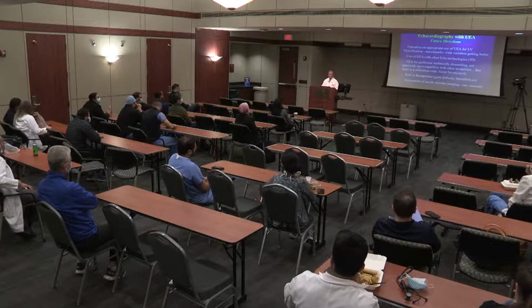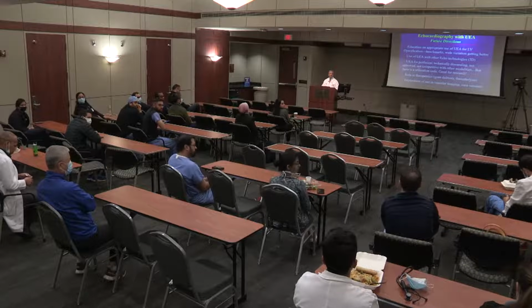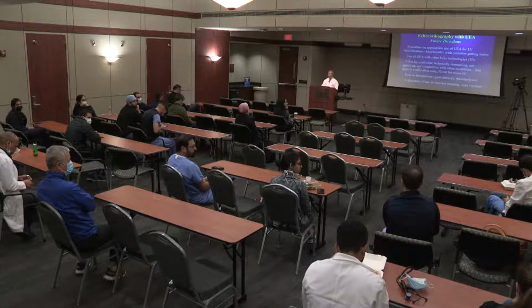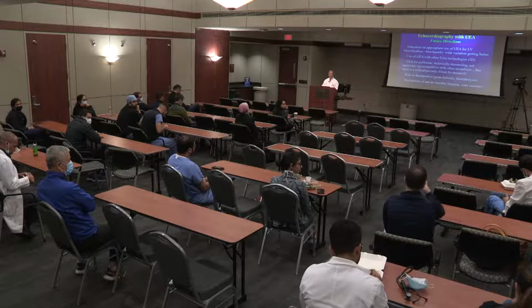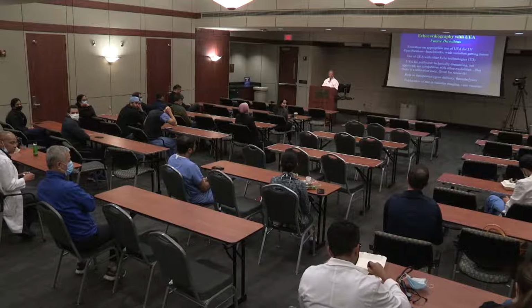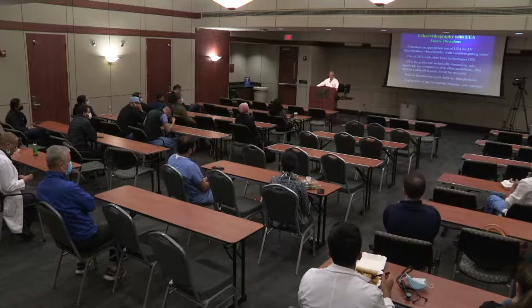Any questions from you or from the audience? Yes, Mahmoud. If you have a study where initially they did non-contrast, and the last set of images they injected contrast, and you had a good TR jet for the non-contrast, but then that TR jet obviously is a little bit more accentuated with contrast. What do you use for PA systolic? The question is, if you have a TR jet that was seen, well delineated before contrast, and then contrast was used, and it was a little higher afterwards, which one do you use?